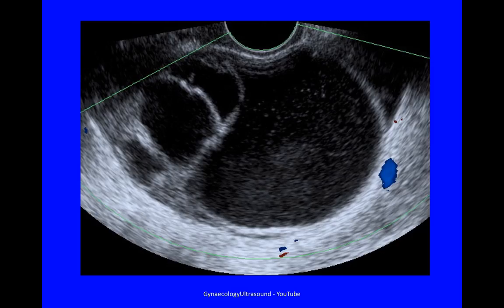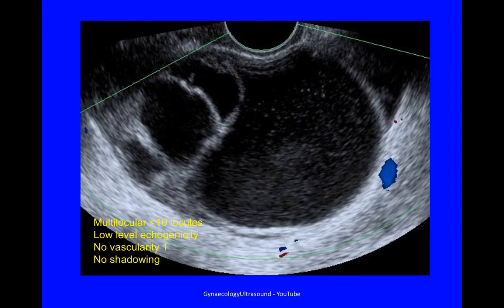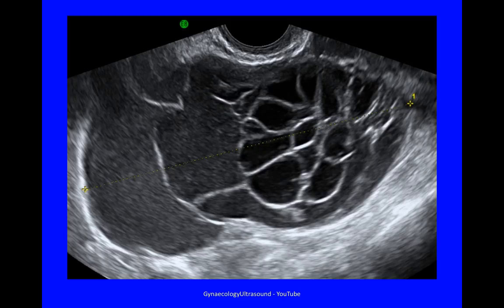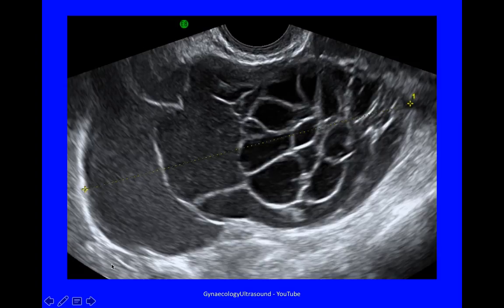This cyst was 87 millimetres — multilocular with fewer than 10 locules, no solid material, low level echogenicity, no vascularity giving a score of 1, and no shadowing. The next cyst was larger at 112 millimetres — multilocular with more than 10 locules, no solid material, low level echogenicity varying between really low level and almost anechoic between the locules, and no shadowing. For shadowing, we always look behind the lesion to see if there are any acoustic shadows.